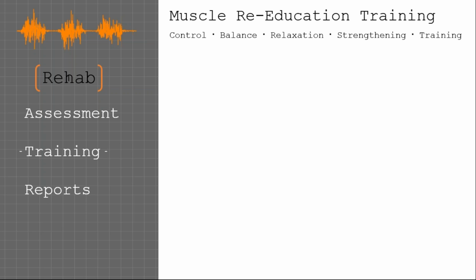Relaxation, like we had seen in the assessment that I had shown quickly, if there's excessive muscle tone, it may be linked to other things that are going on. If we're especially stressed and we're storing a lot of tension in our shoulders, there may be extra fatigue or things like that going on. Tying back to some research that's been done, some excessive trap muscle tension may be tied back to something like headaches. From the performance standpoint, if you're holding excess muscle tension, then you're going to become fatigued quicker and you're not going to perform as well.